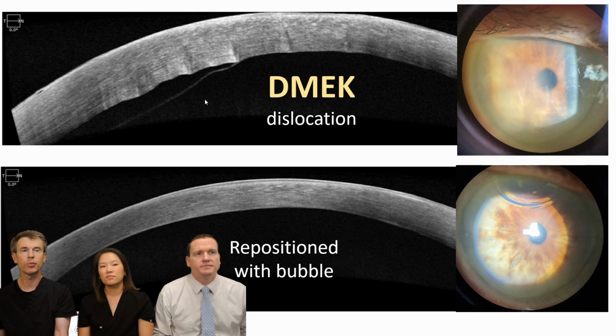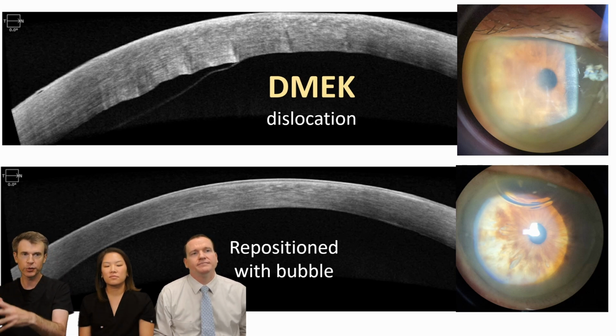So also, again, at one day post-op, some people ask, oh, why do they have endothelial folds? Isn't it attached? Is that edema? Well, obviously they had edema, and it's just kind of getting over that, so they will resolve over time.